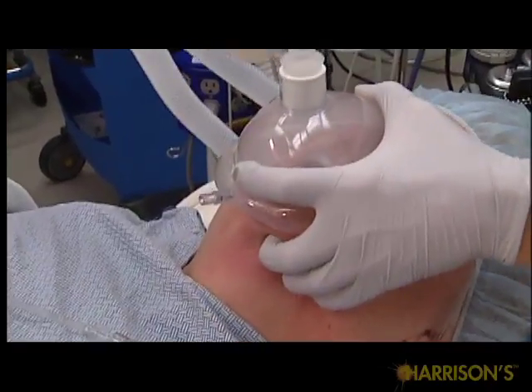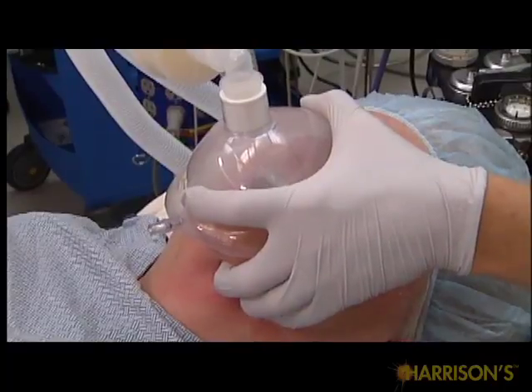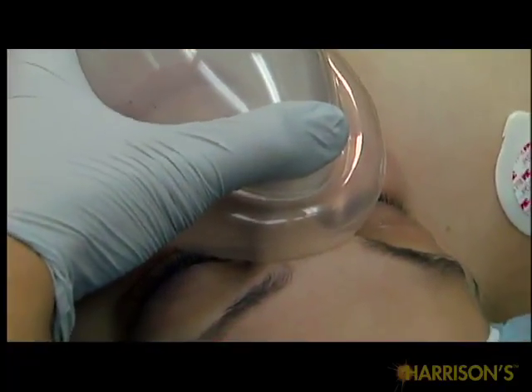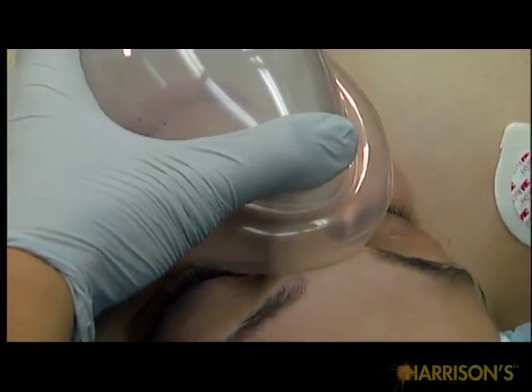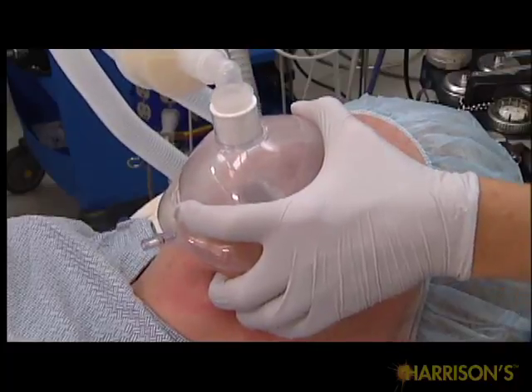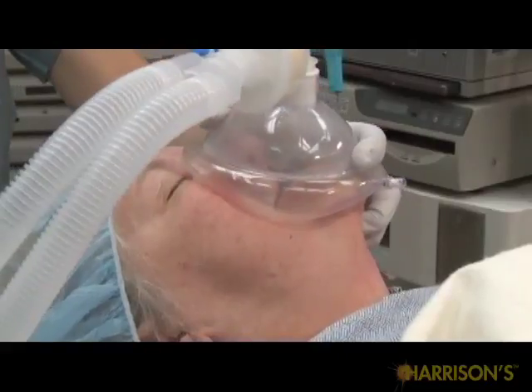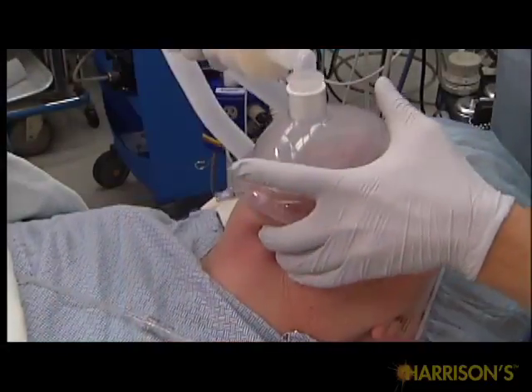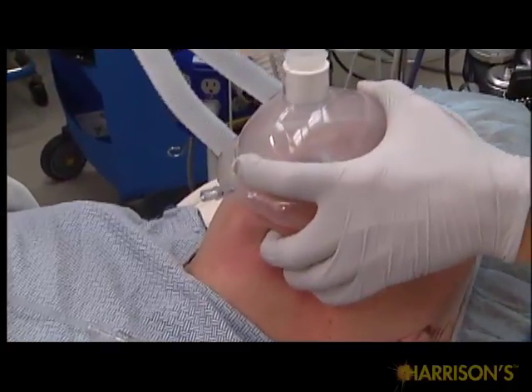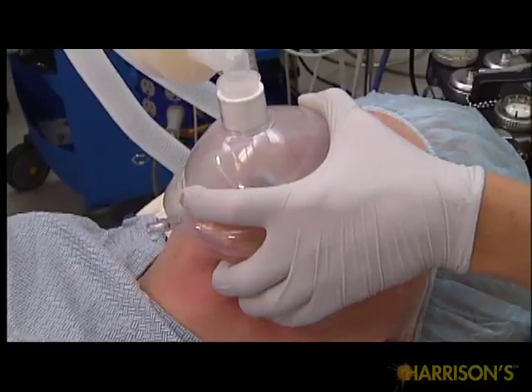For proper mask ventilation technique, allow the left thumb to rest above the connector and the index finger below the connector on the mask. Apply the tip of the teardrop-shaped mask to the nasal bridge. Firmly hold the left mandible with the third and fourth fingers of the left hand. The inferior rim of the mask should rest between the patient's lower lip and chin. Place the fifth finger behind the mandible and use the third to fifth fingers to pull the patient's face up to the mask, rather than pushing the mask down to the patient's face.